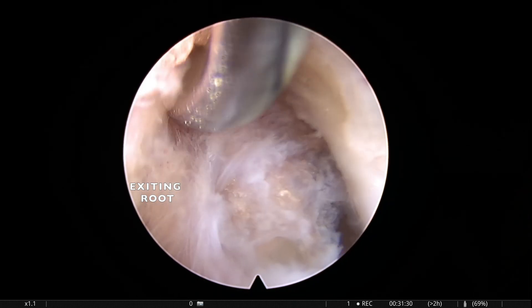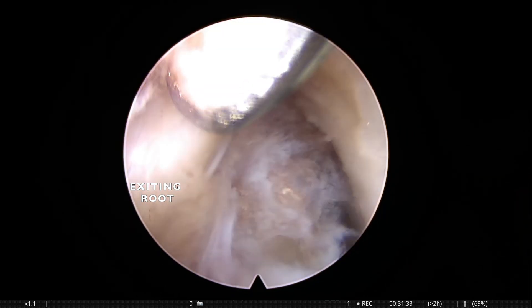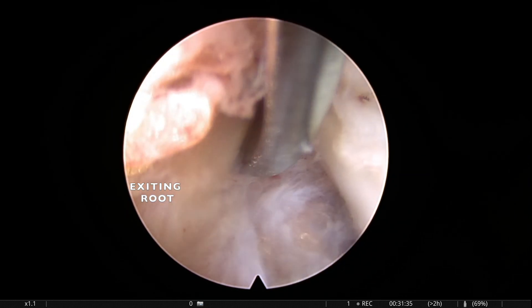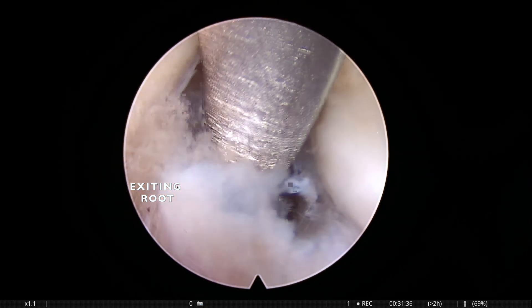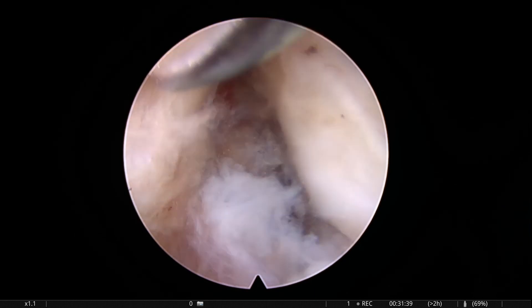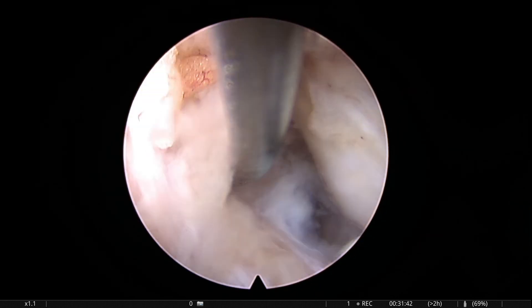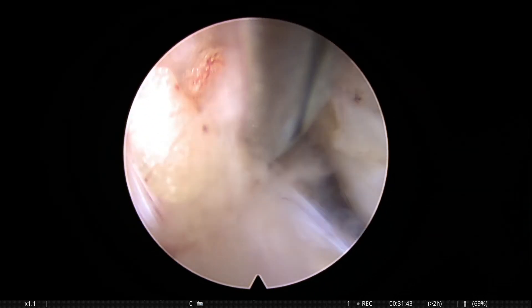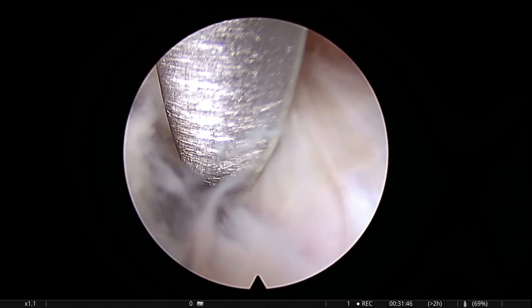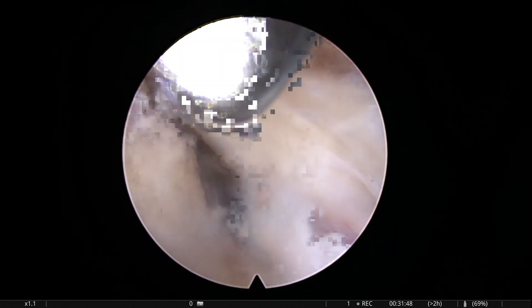You can see the exiting root clearly. The annular surface is free now. Below the exiting root there is no fragment. The annular surface is confirmed clear and the root is free. Hemostasis is attained and the cannula is removed.